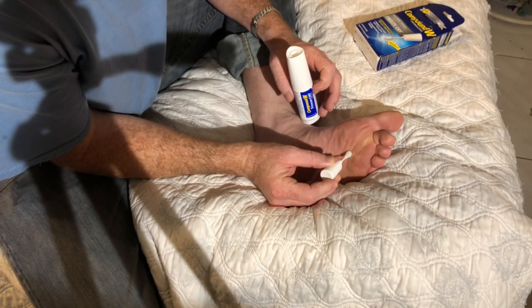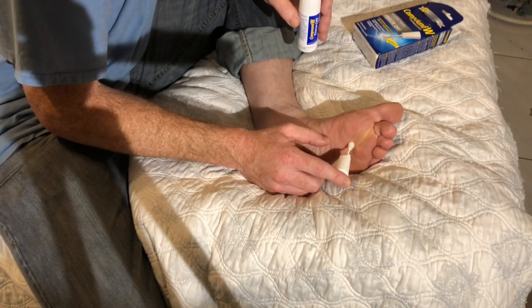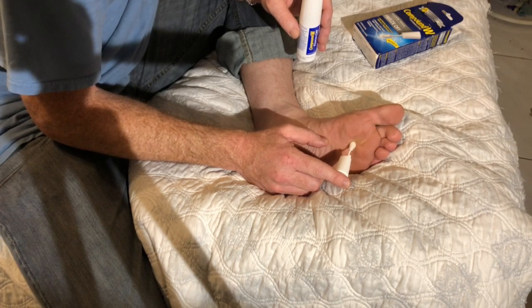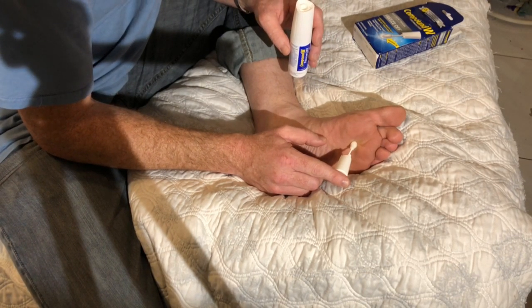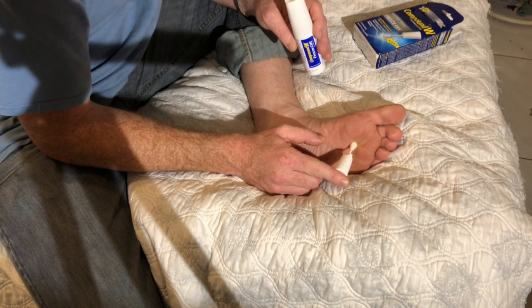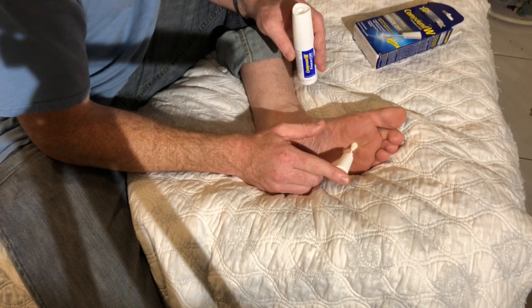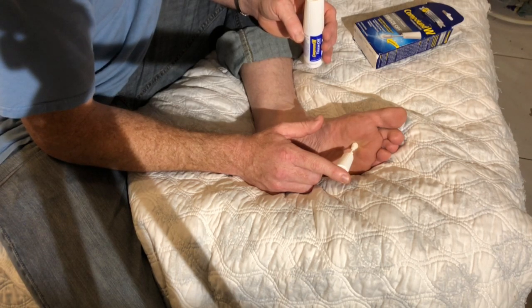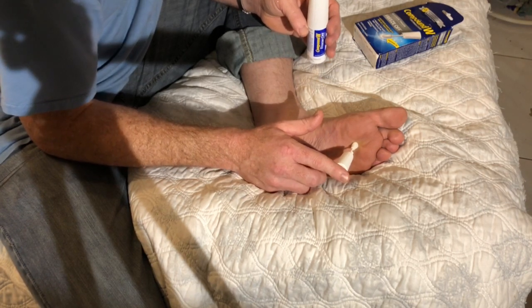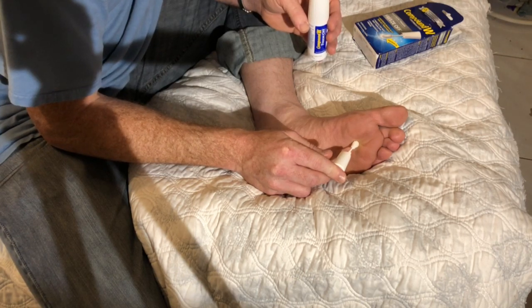Press it against the wart — do not swab. Now holding for 40 seconds, counting up through 40.